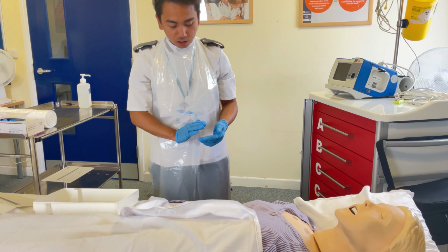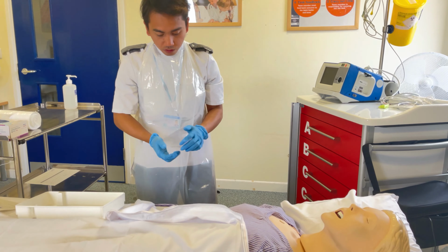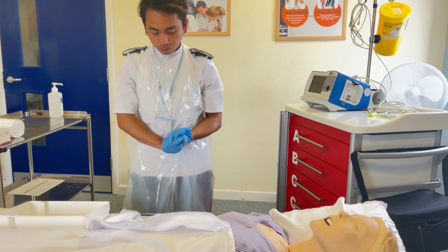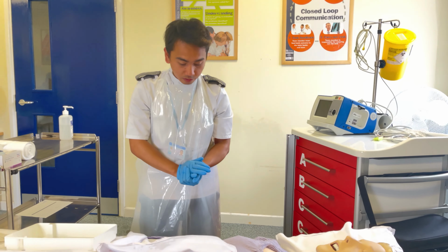What are we going to do? We just need to resite the cannula. Okay? All right, so assessor, can you assume that the resiting of the cannula has been done? All right then. So I'll now proceed with the flushing of the cannula.